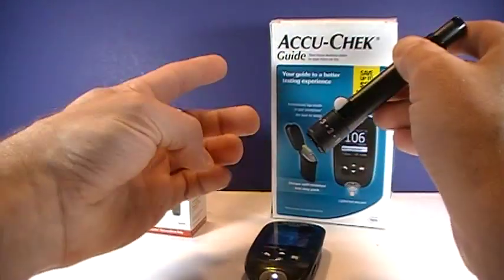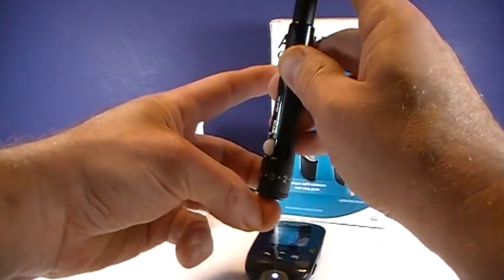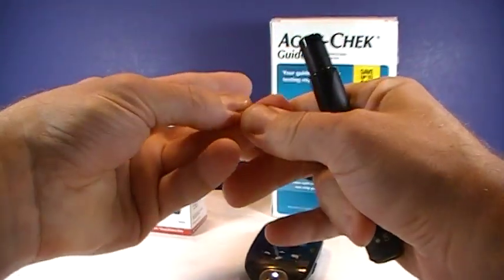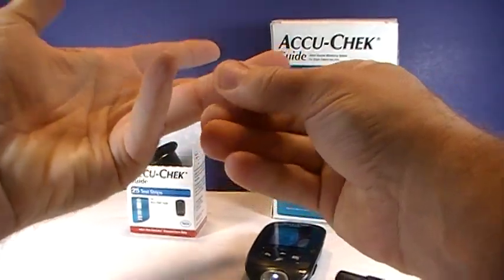You want to make sure you wash your hands with warm, soapy water and thoroughly dry them first. Then you put that on there — and there we go, a nice drop of blood.